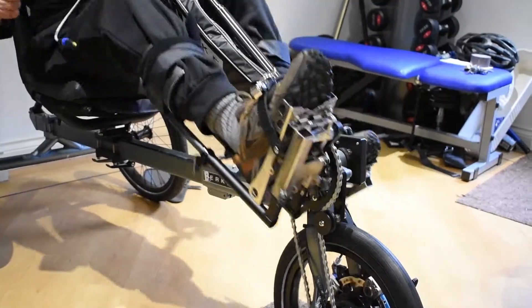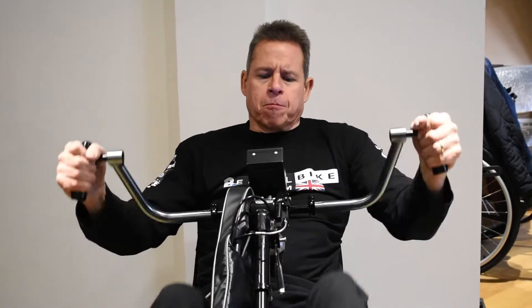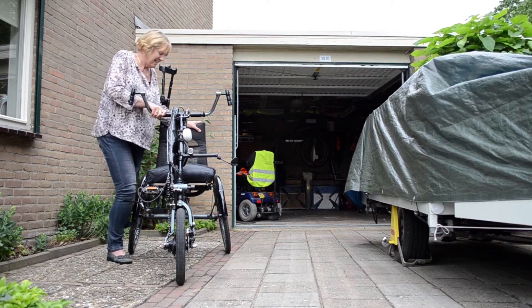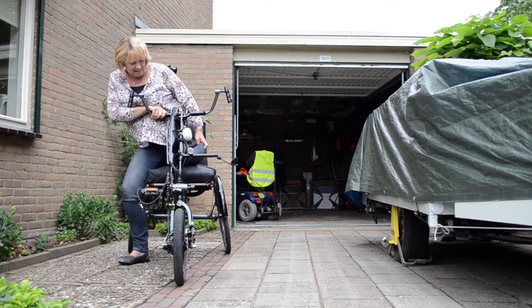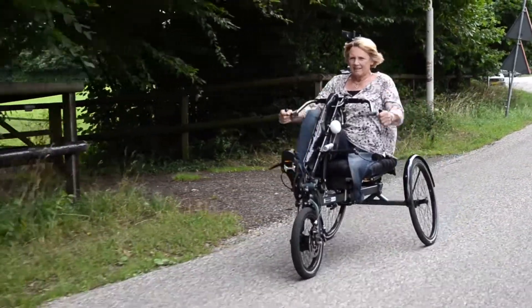When you rotate the handlebars, the foot pedals rotate automatically. You can support the movement of your legs with the power of your arms and shoulders. Even if your legs have lost a lot of strength and coordination, cycling is often possible with the help of the arms.